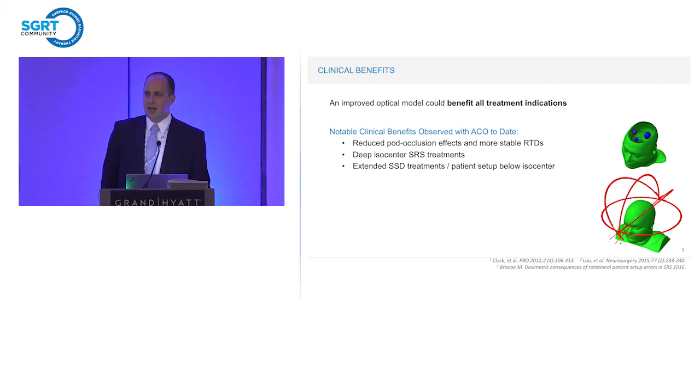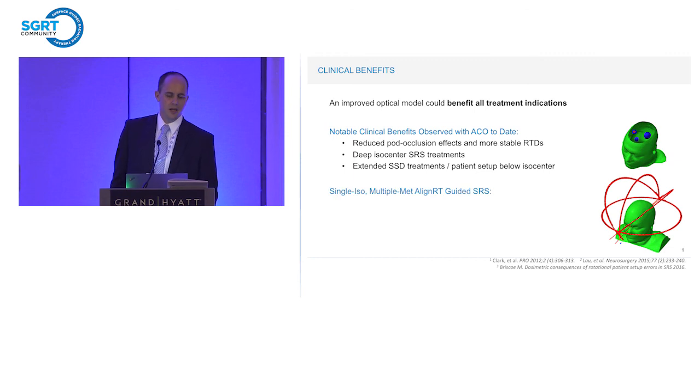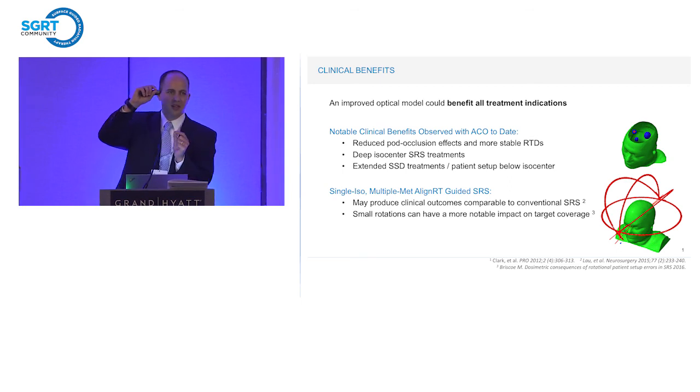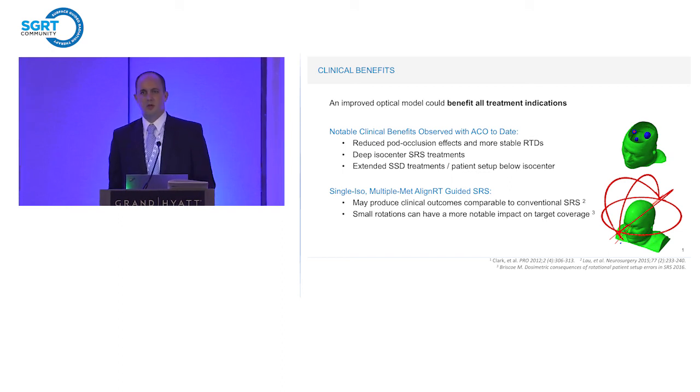One area I like to highlight with respect to these kind of accuracy levels is when we're treating single isocenter SRS treatments with multiple METs. So as we know, under these situations, if you have a distant MET away from isocenter, we're very sensitive to patient rotation in particular, where if the patient rotates a small amount, you get that kind of lever arm effect, where a small rotation at a large distance could lead to a relatively large motion far away. So under this case, it's extremely important we know where the patient is throughout treatment.